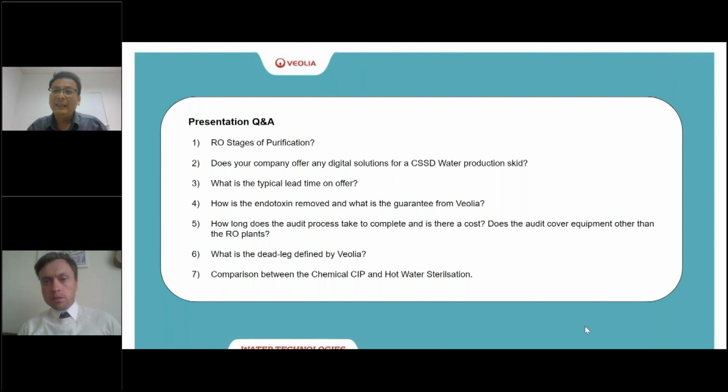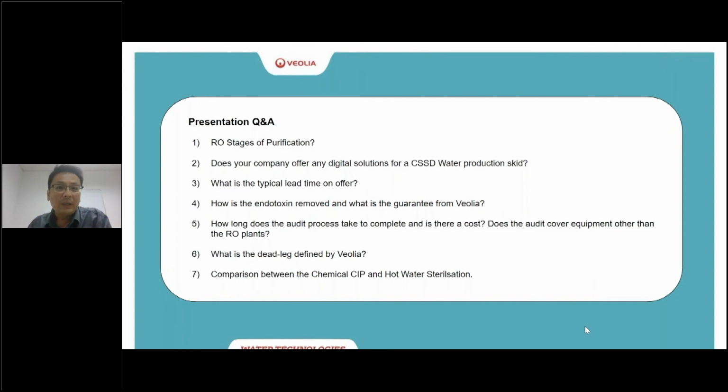Certification itself basically comes from the factory acceptance test and the site acceptance test of the system itself. Before the system is delivered to the customer site, we usually conduct a round of factory acceptance tests to make sure that the materials of construction in contact with the water, from a material or even a gasket perspective, have the certifications to the FDA requirements.